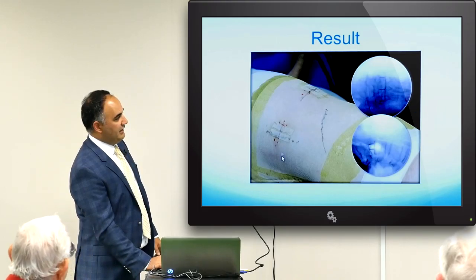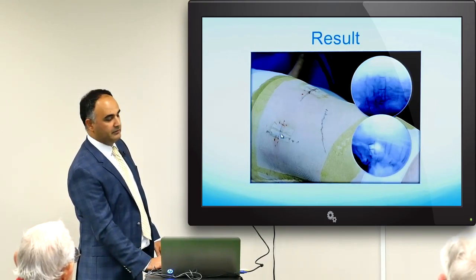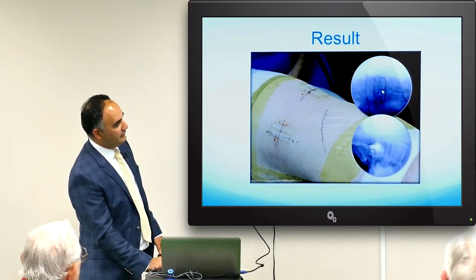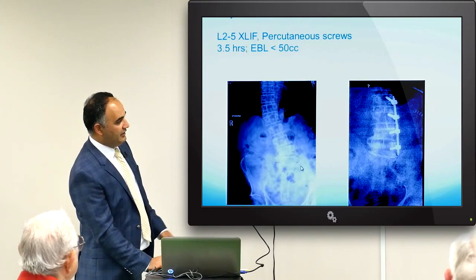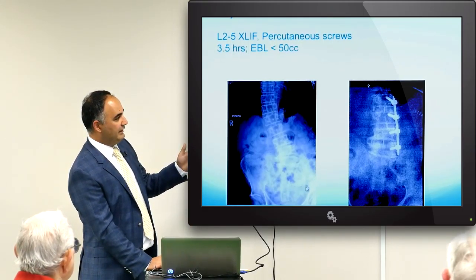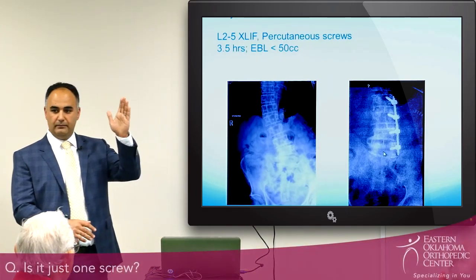And this is the result. So you get 2 incisions, one up here about a couple inches and one back here about an inch or so. And this is that cage. So we can put the cage, this is looking at it straight on. And you can take someone that looks like this with a curve in their spine, come in from the side here and put those cages in one by one and build them back up.